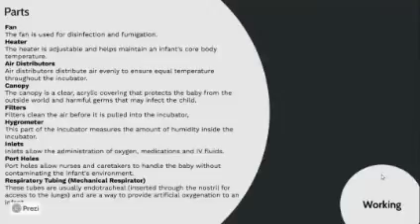An incubator contains a filter to filter all the pollutants, dust particles, bacteria, etc. from the incubator. A hygrometer, which is used to measure the humidity inside the incubator. The inlets that allow administering oxygen, medication, and IV fluid to the infant. Portholes that allow the nurses to handle the infant without contaminating the infant's environment. Respiratory tubes. The tubes usually are endotracheal, meaning they are inserted through the nostril to access the lungs, and are a way to provide artificial oxygen to an infant.